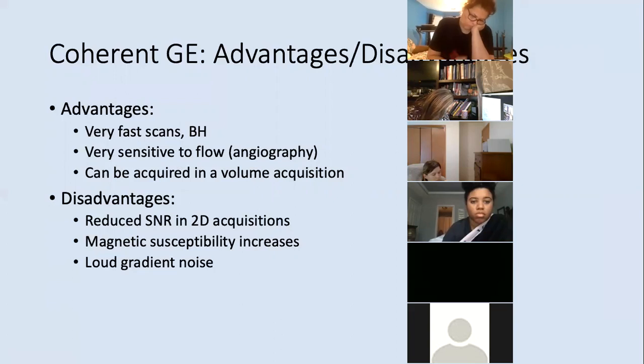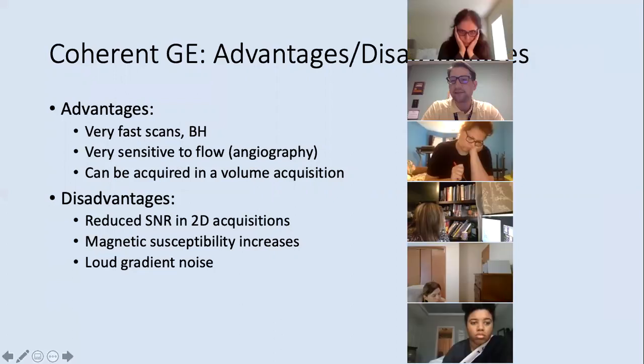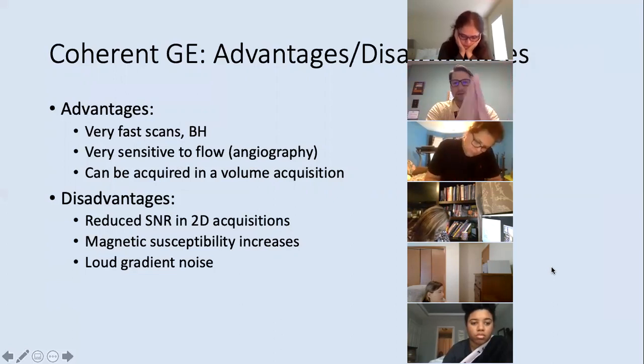So on your scanner, you might have come across where instead of increasing your amount of slices, you want to increase your slab. So that's what it means by 3D. You're getting a slab of tissue instead of just a particular slice.